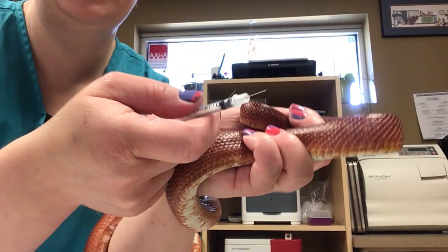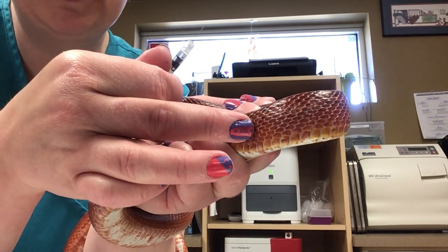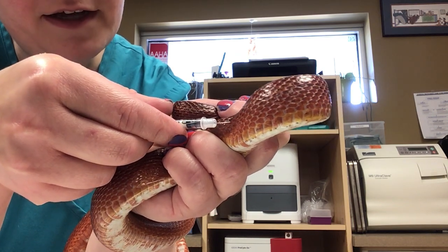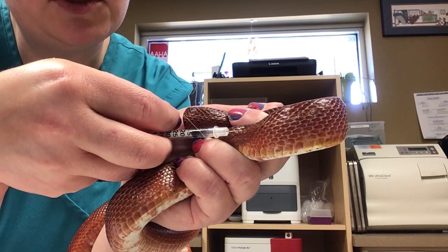You can see the scales are going this way and I want to tuck up under them. So I'm going to go into this meaty area just to the side of the spine. I've got my bevel up and I'm just going to slide right under one of the scales. Then I'm using my pinky to pull back on the plunger to make sure I'm not in the bloodstream.